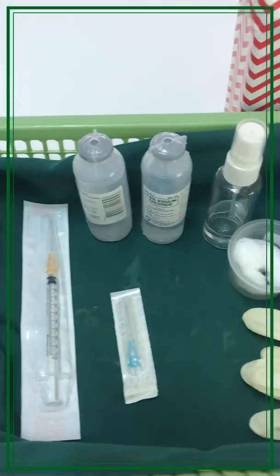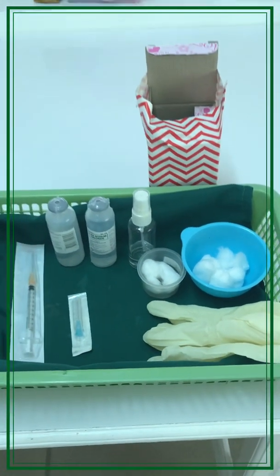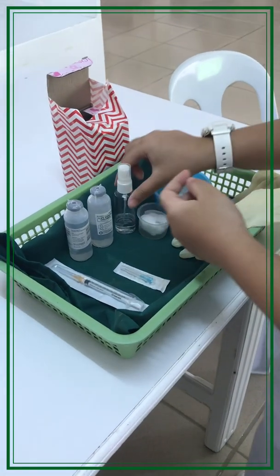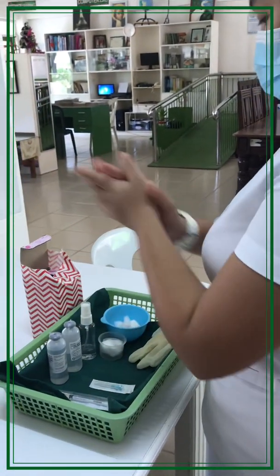Check the physician's order, as this ensures that the patient receives the right medication at the right time by the right route. Perform hand hygiene and wear disposable gloves, and assemble all needed equipment.